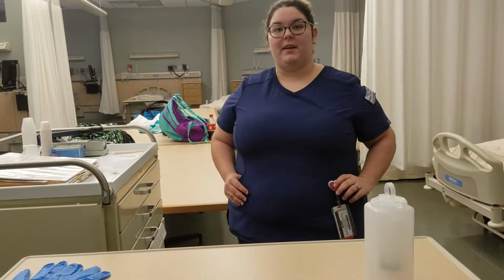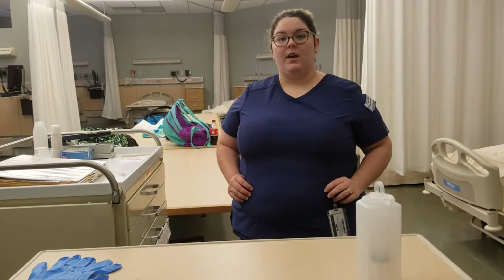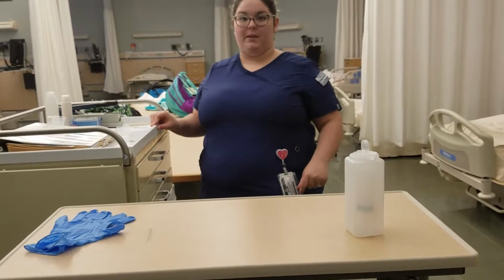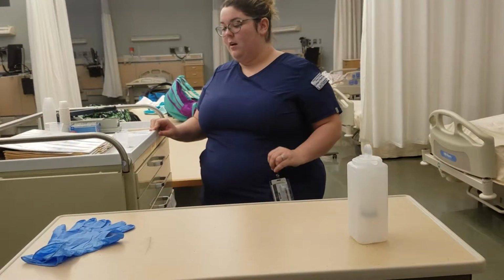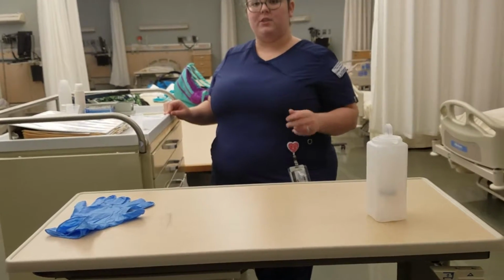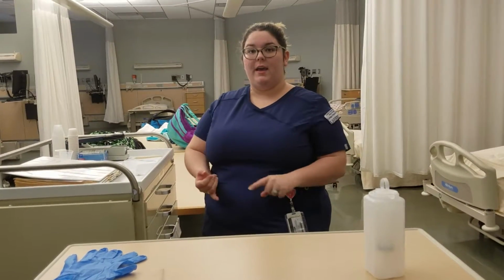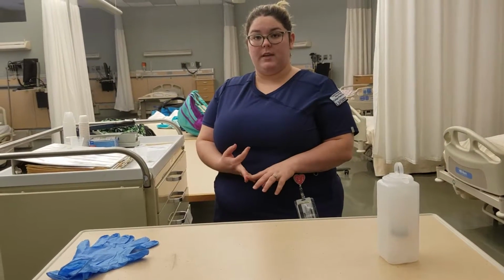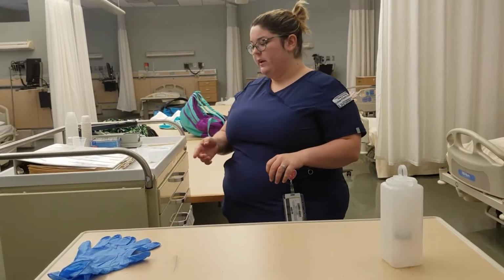My name's Taylor. I'm going to be demonstrating how to administer medication through a PEG tube and also the differences between a PEG tube and an NG tube. The differences would be that for an NG tube, you always have to check for placement. You can do that by x-ray. You can also aspirate and auscultate. Also, you can check the pH.